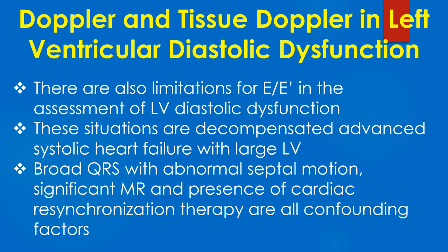There are also limitations for E by E prime in the assessment of LV diastolic dysfunction. These situations are decompensated advanced systolic heart failure with large LV, broad QRS with abnormal septal motion, significant MR, and presence of cardiac resynchronization therapy, which are all confounding factors.